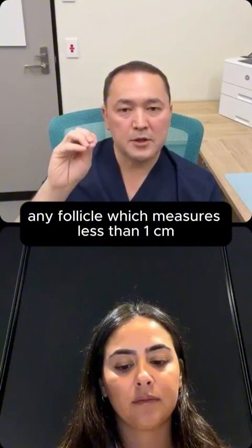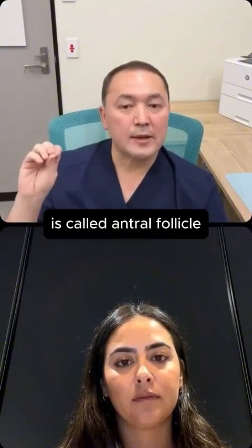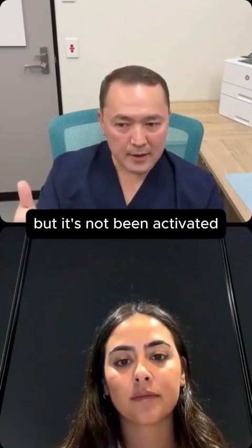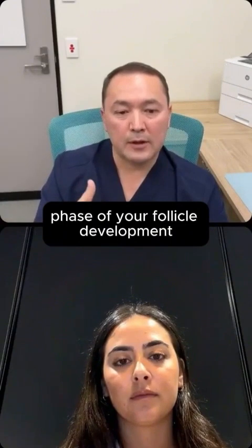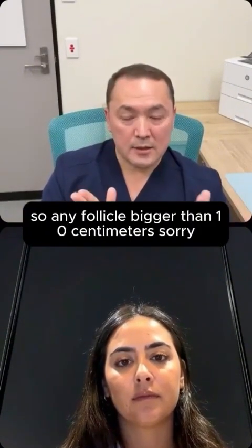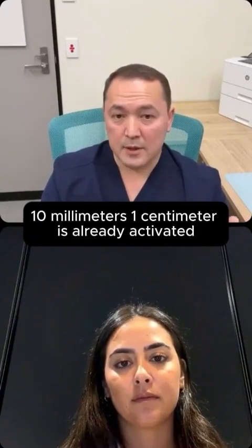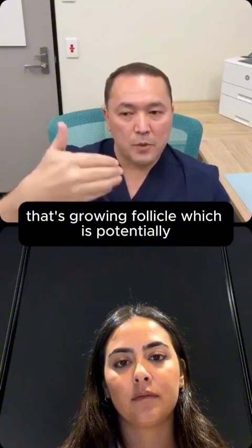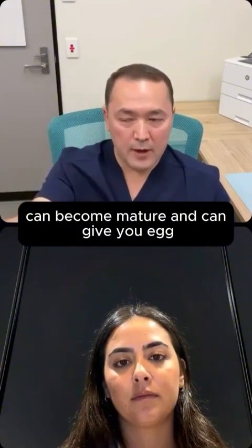Any follicle which measures less than 1 centimeter is called an antral follicle. This follicle is there, but it has not been activated. It's not going into the growth phase of follicle development. Any follicle bigger than 10 millimeters, 1 centimeter, is already activated. That's a growing follicle, which can potentially become mature and give you an egg.